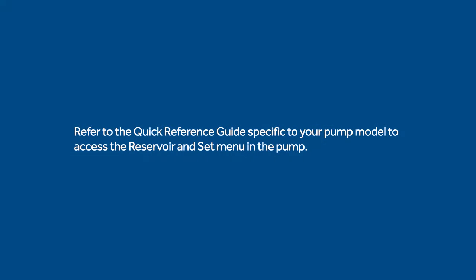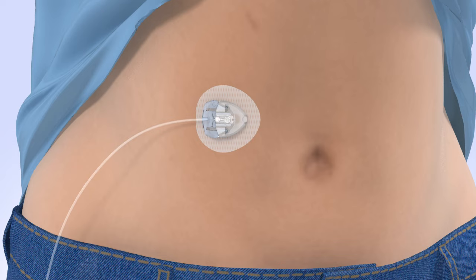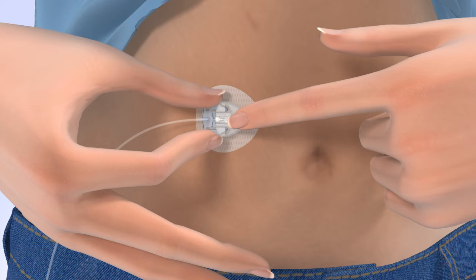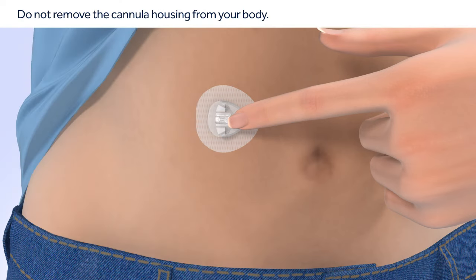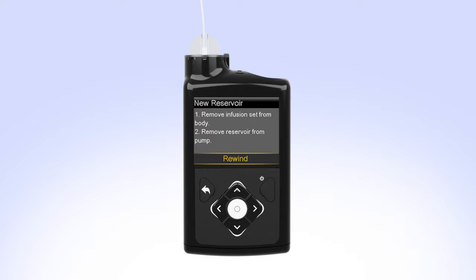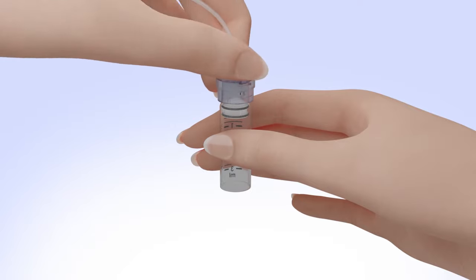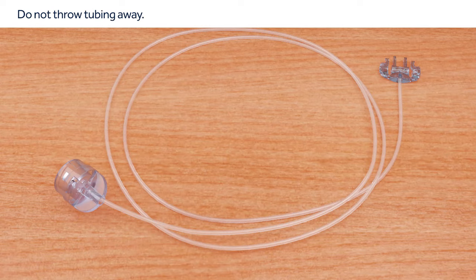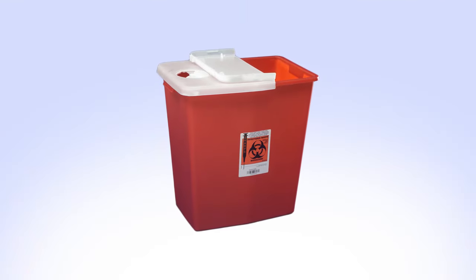The first step is to access the reservoir and set menu in your pump. Refer to the instructions in the quick reference guide specific to your pump model. Now you will need to disconnect the site connector from the cannula housing. Gently hold the cannula housing steady with your finger, then squeeze the sides of your site connector and pull it away from the cannula housing. Be sure you do not remove the cannula housing from your body. Remove the reservoir from your pump by turning the tubing connector counterclockwise. Disconnect the infusion set tubing connector from the used reservoir. Place the tubing on a clean surface — do not throw it away. Safely dispose of the used reservoir.